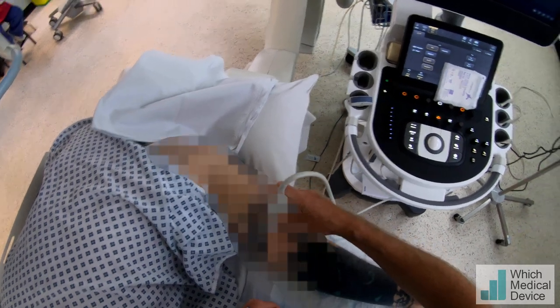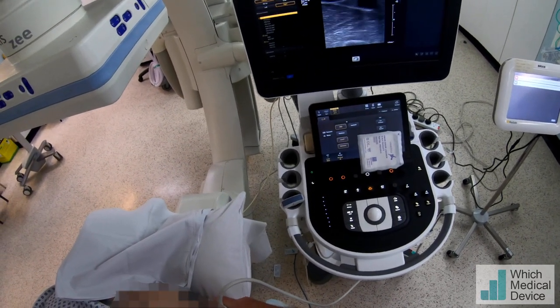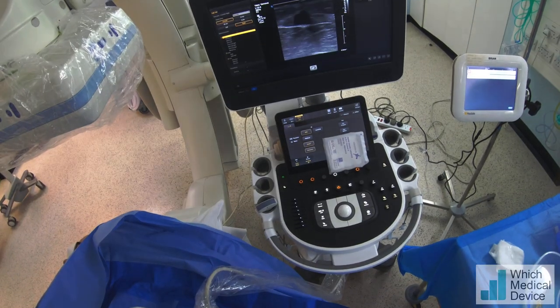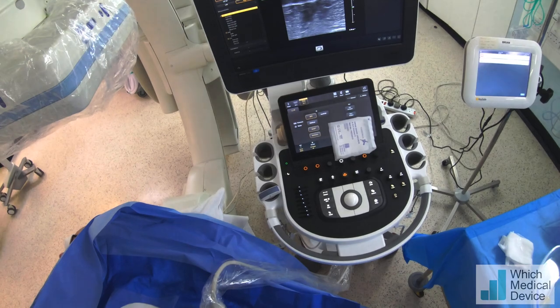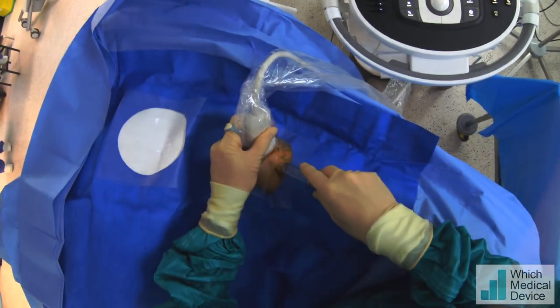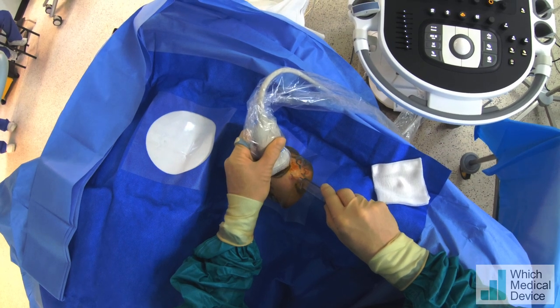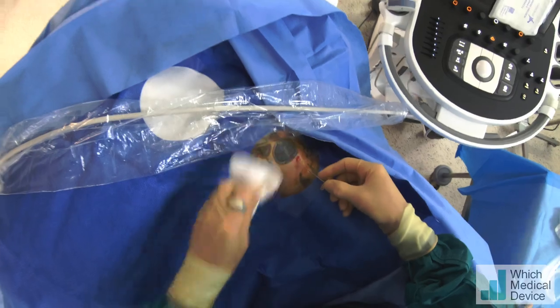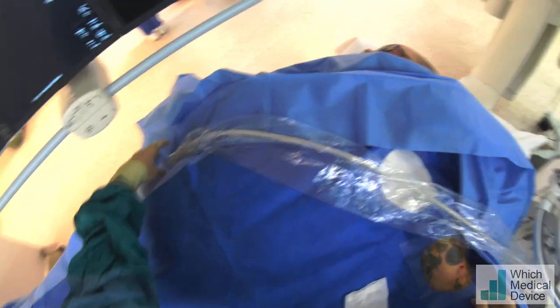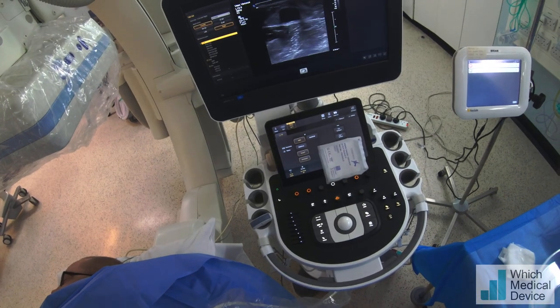That's the area we're almost certainly going to have to treat. The first thing we're going to do is puncture the venous side of the fistula and do a venogram to confirm that. I'm going to put a little bit of local anesthetic in — it's going to be a little bit sharp — okay, a bit of a sting as we numb that up. There's going to be some pressing but it shouldn't be particularly uncomfortable.